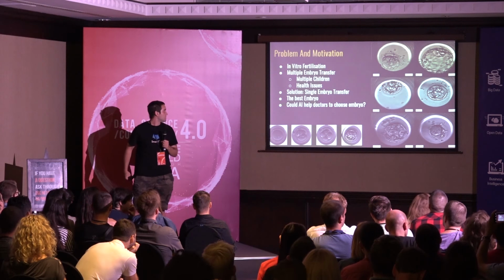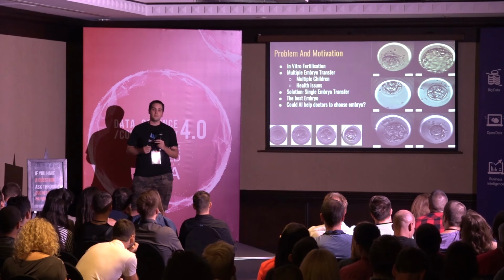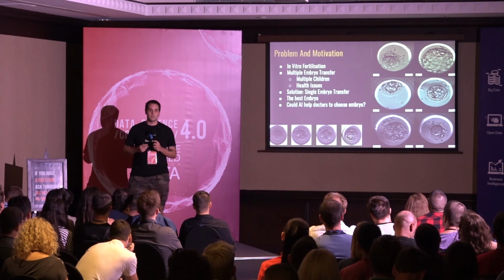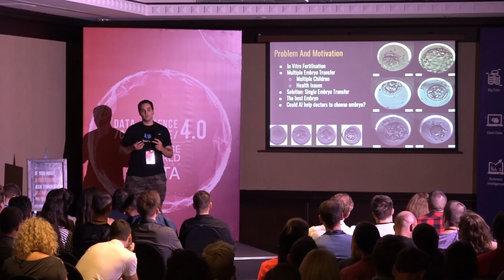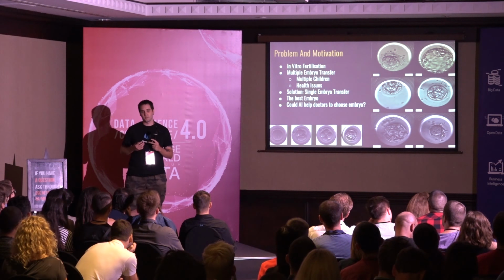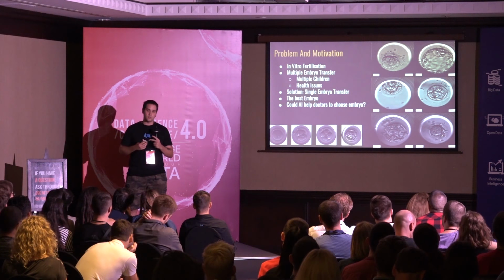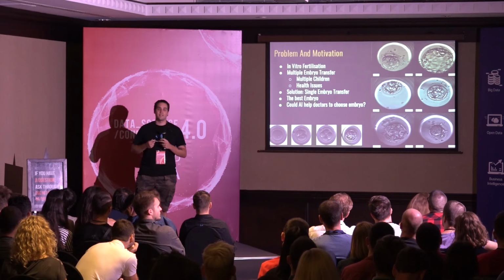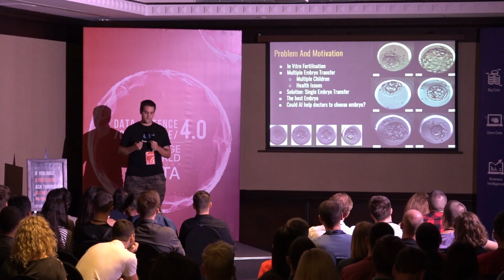In vitro fertilization, doctors often transfer multiple embryos into the mother in order to achieve the highest chance of at least one succeeding.